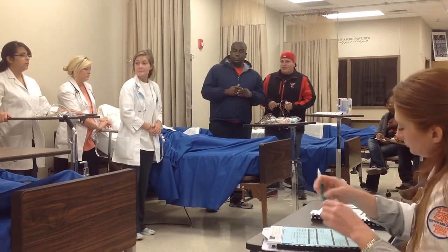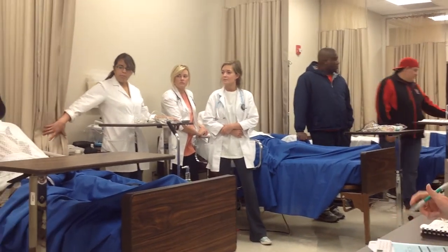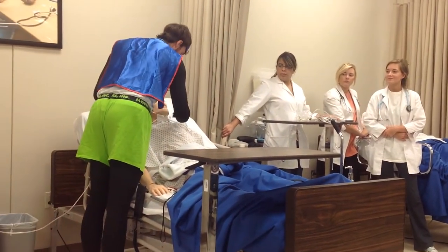Okay, so he's assessed the skin integrity. He's going to be using a nasal cannula. You're going to put both prongs facing down into the nose. And then the cord just goes right over the ears.